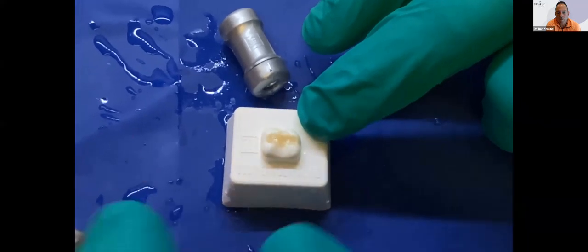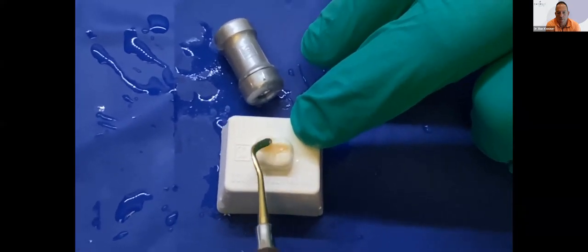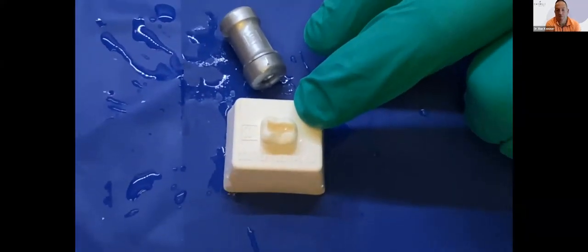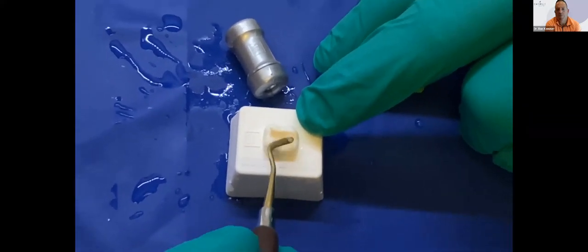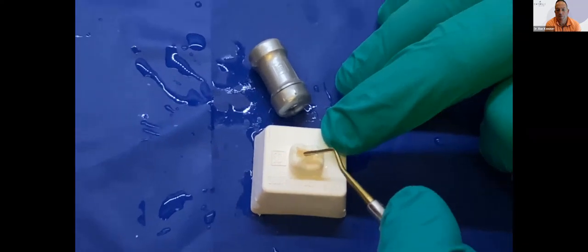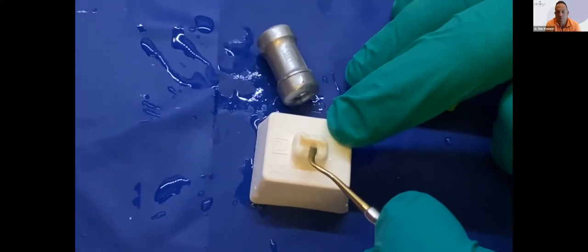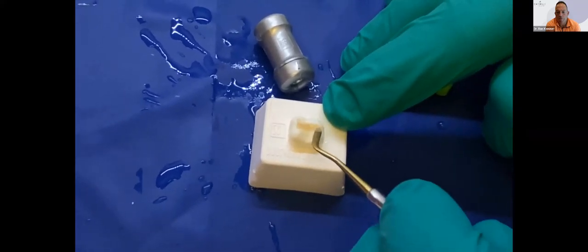Now, I would be using SDI's curing light right now, but my hygienist is placing sealants and she's using the light. But I'm just going to go ahead and finish off this restoration. The handling of that Aura is really, really nice. And we're just about through. I'm going to hit that now with the curing light.